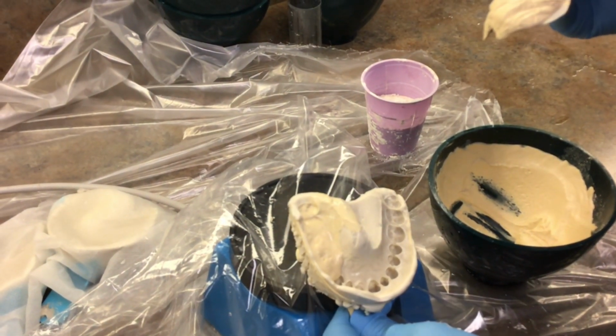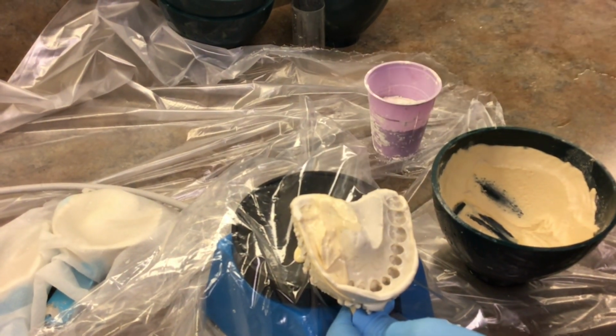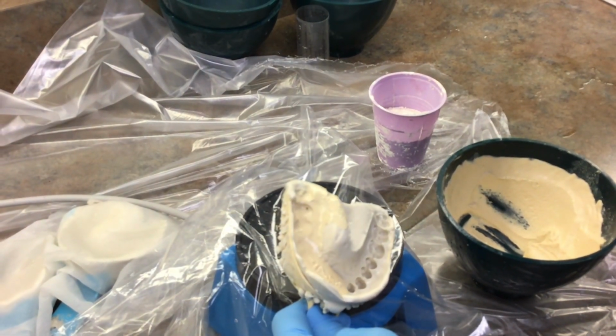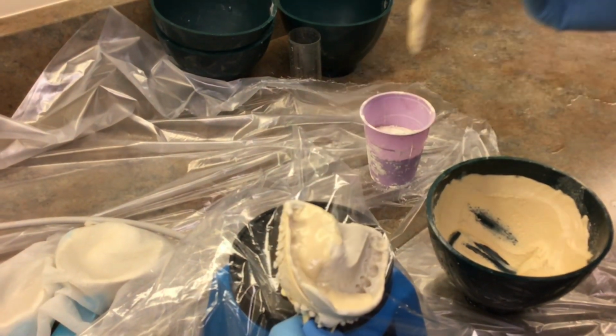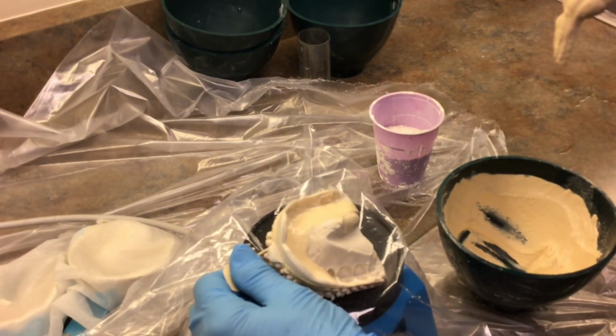When you do it this way, and you keep adding right here where you started, that rolling is going into every tooth and actually flowing into it, so you're not going to get air bubbles. So I'm going to flow, flow, flow as slow as I can. Now again, I'm going to add right here so it can continue. Keep rolling, rolling, rolling.